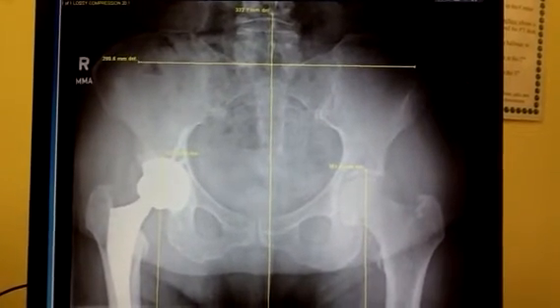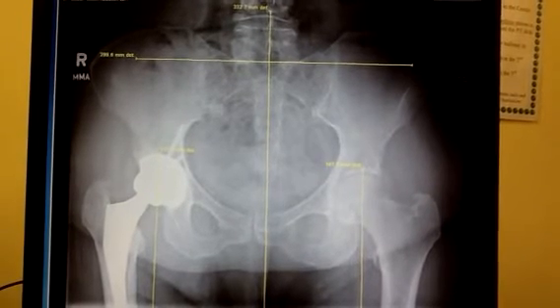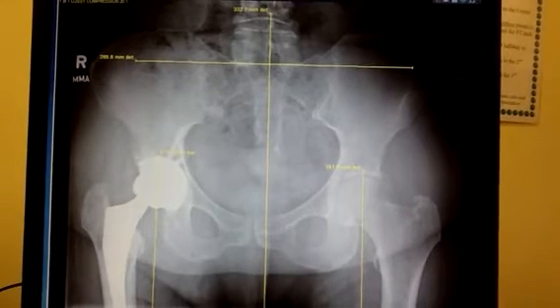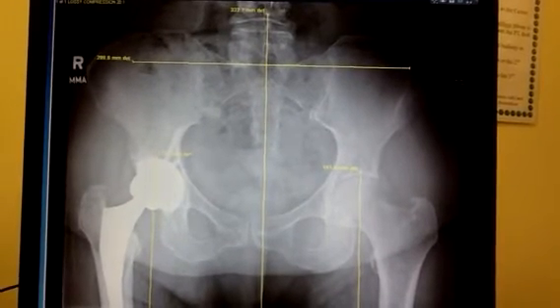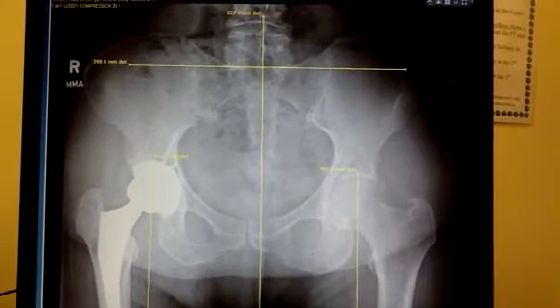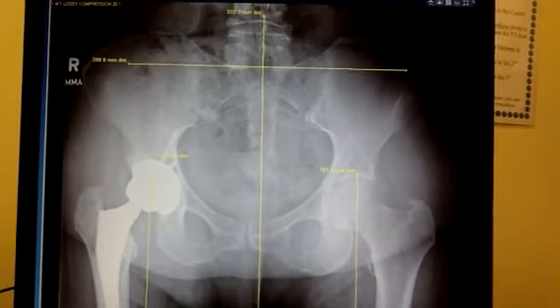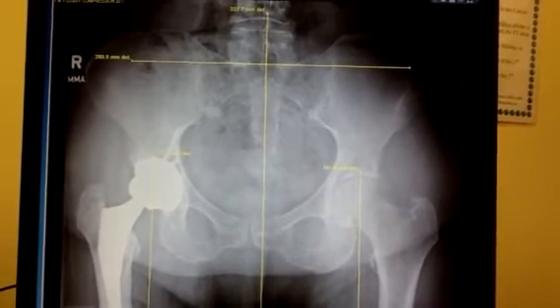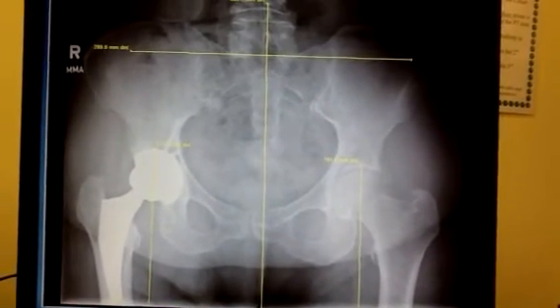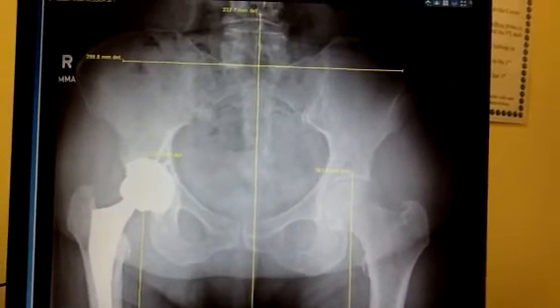Here is a typical hip x-ray that we see after a hip replacement. The base of the spine, which is the horizontal line, is fairly level. There is a little offset at the sacroiliac joint, which looks lower on the right side.